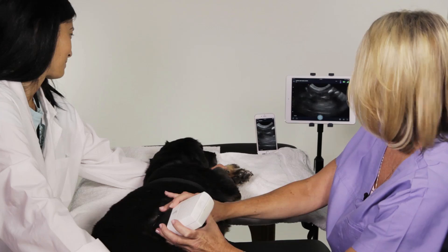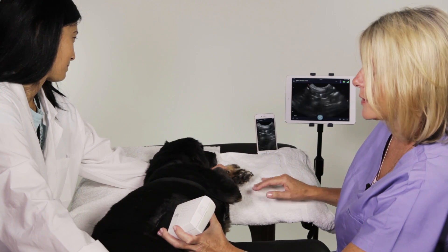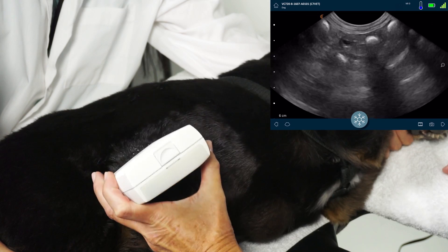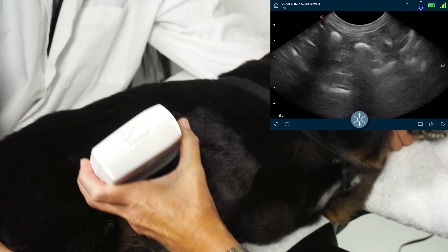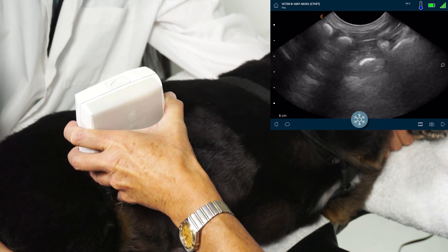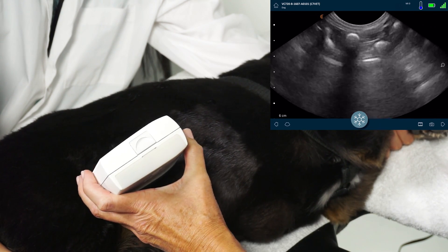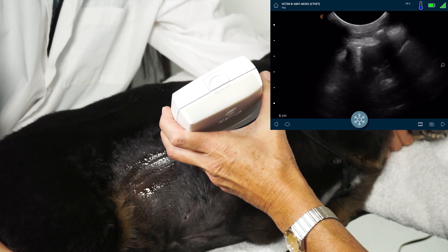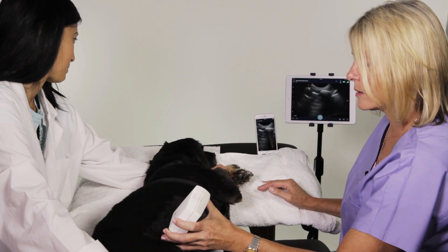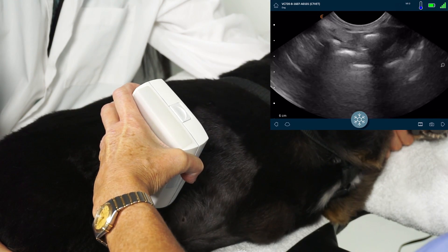There are several different movements to use when you're scanning. So you can fan — we're in the view that we're in, we can fan the view, so we're actually angling through the organ. We can also slide, which is actually moving the transducer from location to location. Rotation is where we actually turn the scanner.